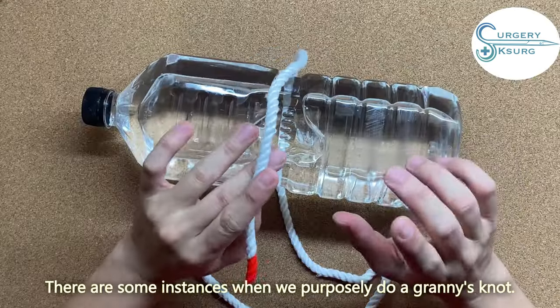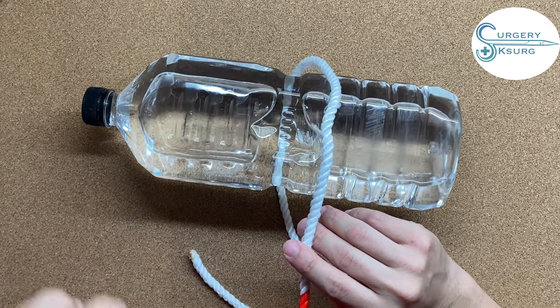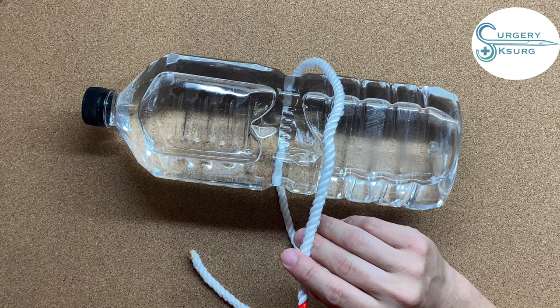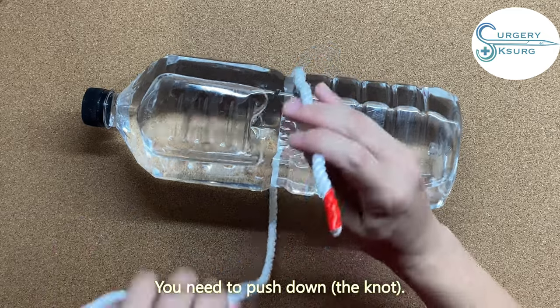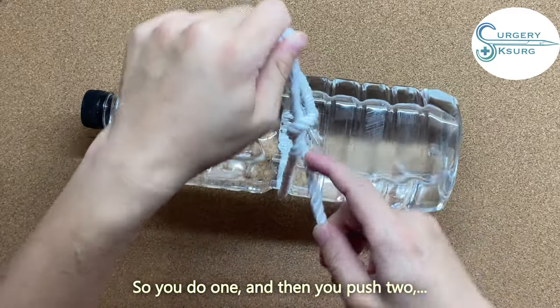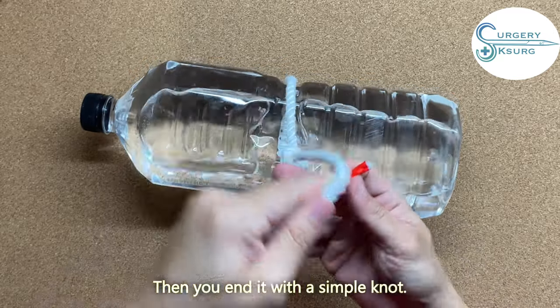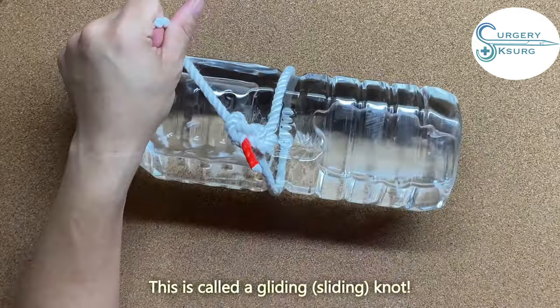There are instances where we purposely do a granny knot — this variation is called a gliding knot. Sometimes you need to put the knot in deeper tissue, so you need to push it down. You purposely don't tighten it too tightly. You do one, push, then two — because this is a granny knot, you can still pull it and slide it down. Then you end it with a simple knot. This is called a gliding knot.